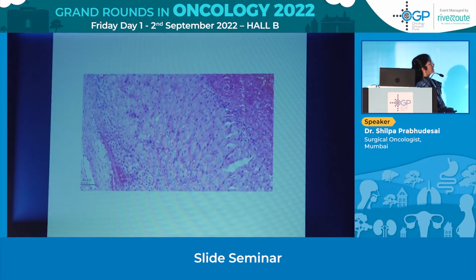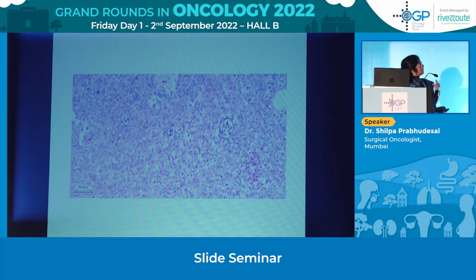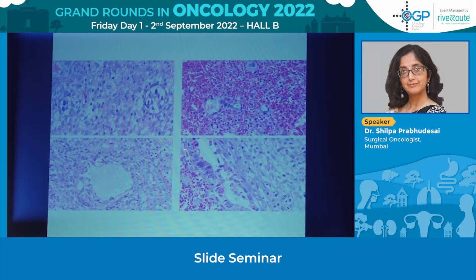So I came in the next morning and like we do for cases that we've left the previous day, took a look at it again. And to my horror and thanks to my guardian angels, I found that I had missed this the previous evening when I was looking at this case. And we can see foci of a tumor. You can appreciate it. There is a vague reticular pattern.